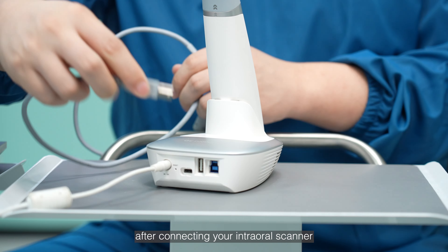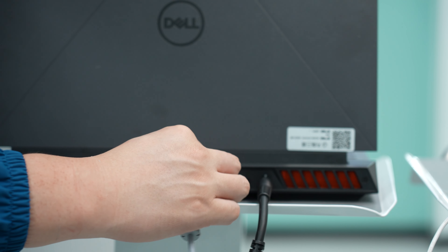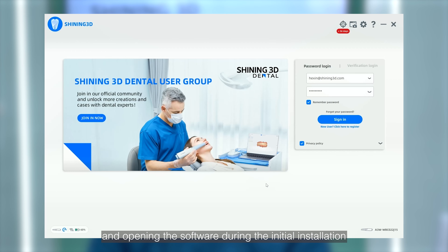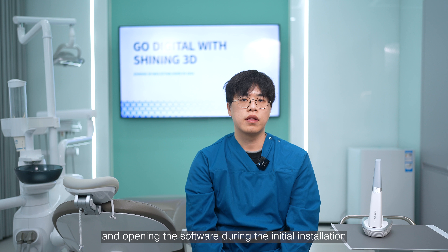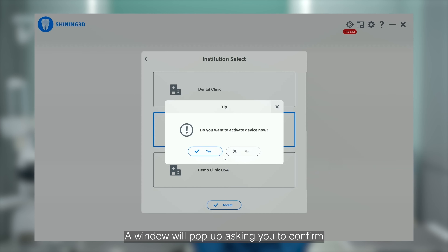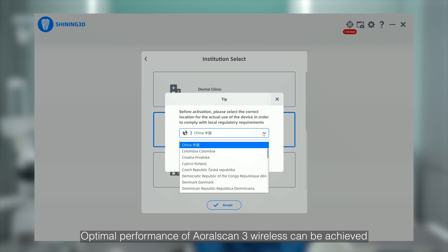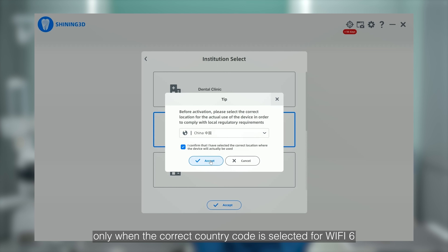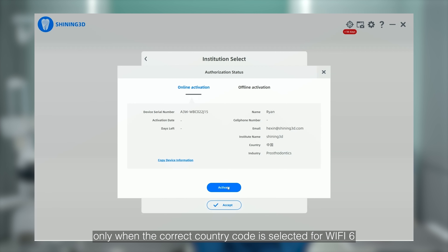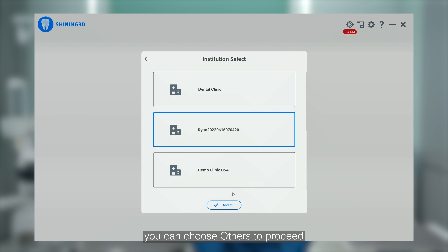To make Wi-Fi 6 workable, after connecting your IntraOral Scanner and opening the software during the initial installation, the software will automatically recognize the country code where your IntraOral Scanner is. A window will pop up asking you to confirm if it is the right one or not. Optimal performance of AuroScan3 wireless can be achieved only when the correct country code is selected for Wi-Fi 6. For countries not in the list, you can choose others to proceed.